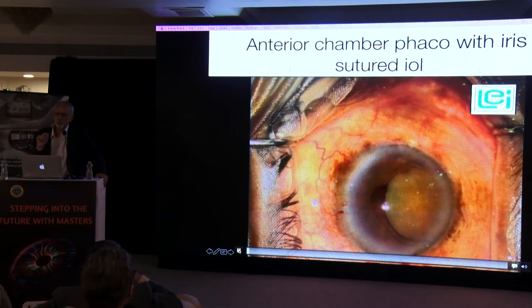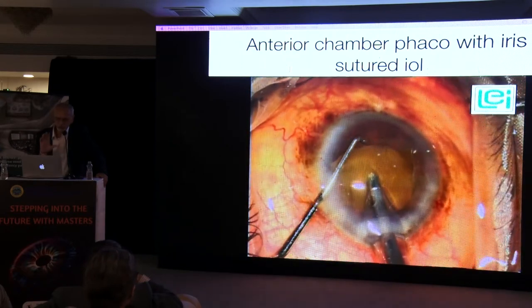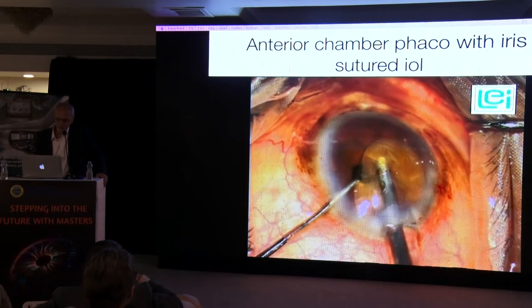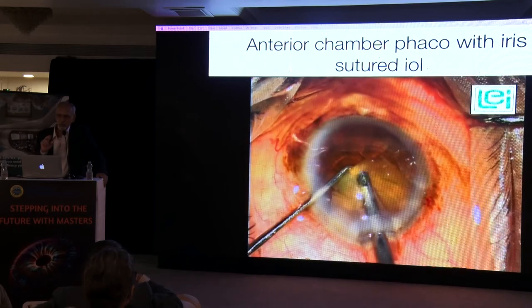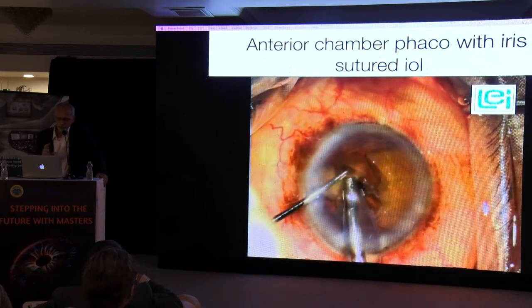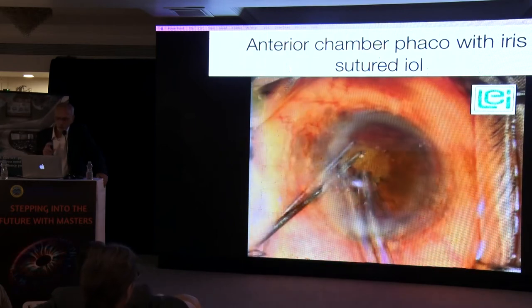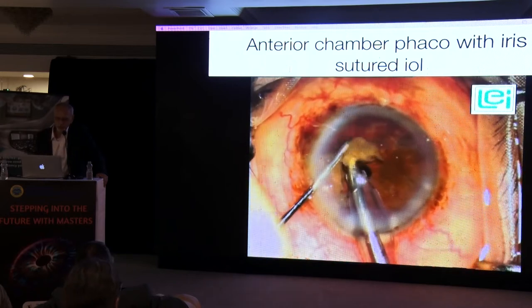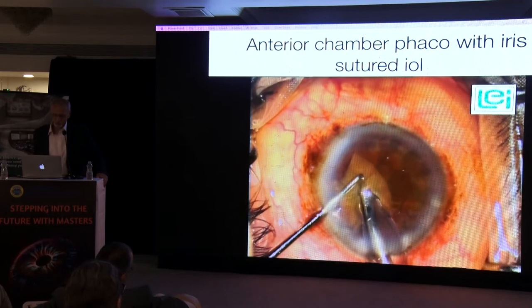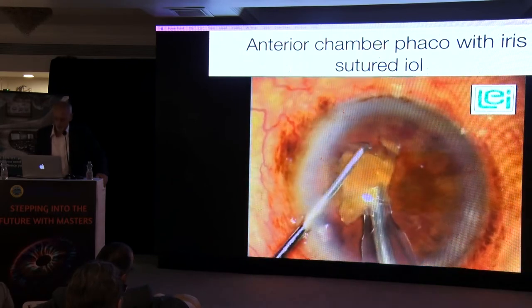First thing I had to do was to put miotic and decrease the pupil size, put dispersive viscoelastic in front of the nucleus, behind the nucleus, use cutter to clear the pupil of vitreous, and constantly with bevel down technique, with very high vacuum and aspiration fluid, I tried to have a good purchase on the nucleus and kept cutting it into smaller and smaller pieces, but all the time keeping my bevel down, because to operate in the AC is a little risky from endothelial point of view. And as luck should have it, the entire thing went off without any issues.